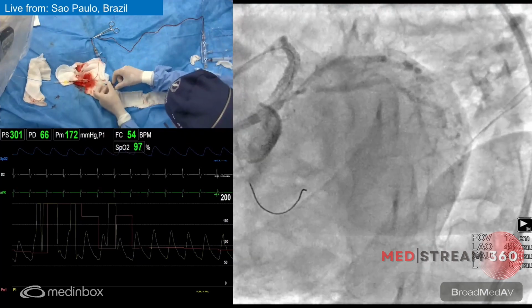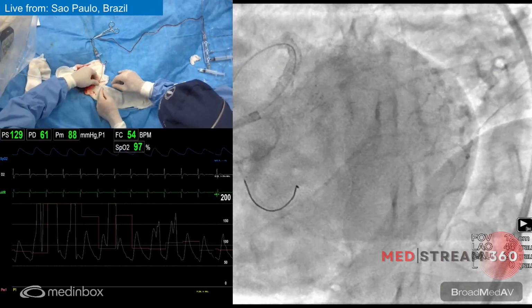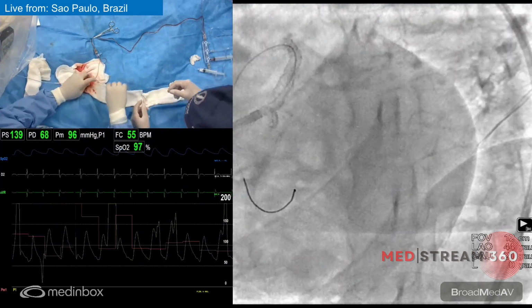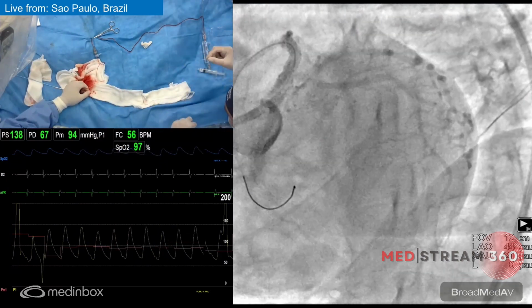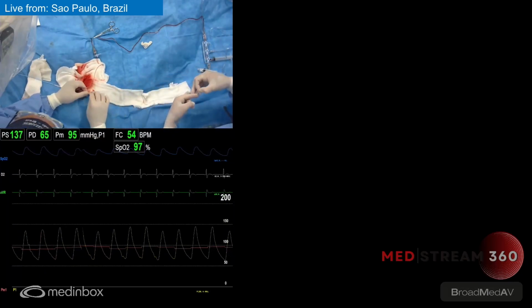Of course, there's a concern if there is progression of disease in the circumflex and you might have to do an opening there. I tend to do it, but there is no wrong here on leaving like this. If you have a TIMI flow 3, no compromise, no signs of dissection. Right, Rodolfo, do you agree? Okay, so we're going to do here control IVUS, and based on what we see, you decide what to do.